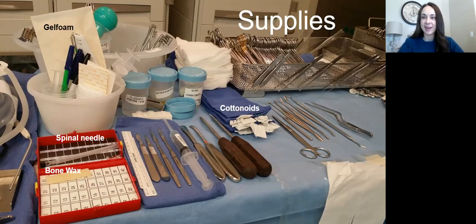And then you'll have lots of hemostatic agents available. So any neuro case I did, we always use FlowSeal, which is not pictured here, but that's mixed with thrombin. One that's very popular in neuro is gel foam with thrombin. So that's what you see right here. They got their gel foam in this package. They pressed it down and then they got some suture scissors and cut it into little bitty squares, probably a quarter of the size of those cottonoids. So they cut it up into all of those squares, and then they have these bayonet forceps ready to hand over to the surgeon. So when they have some bleeding that they want to help stop and not use bipolar or Bovie, they're going to use that gel foam with thrombin to help with that.